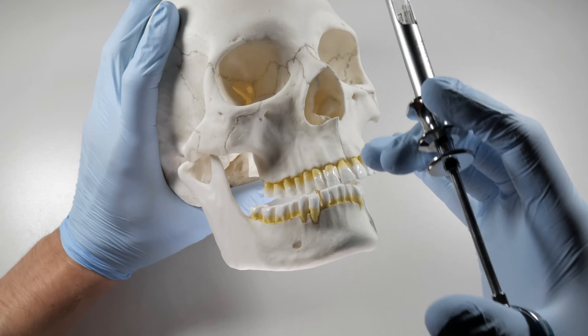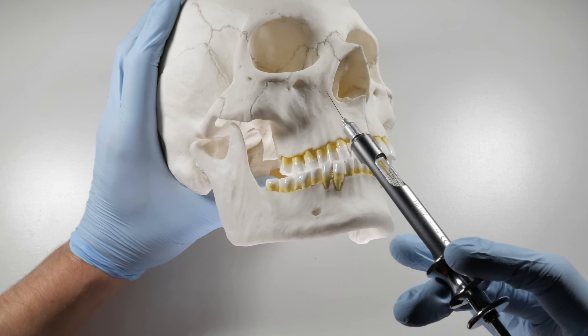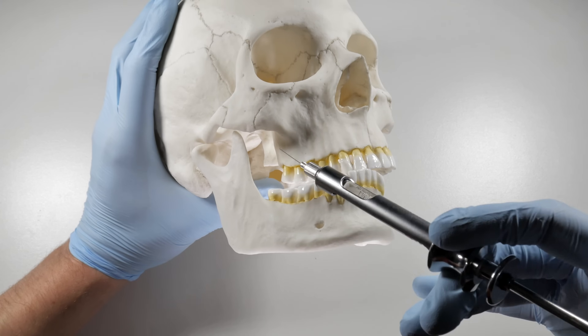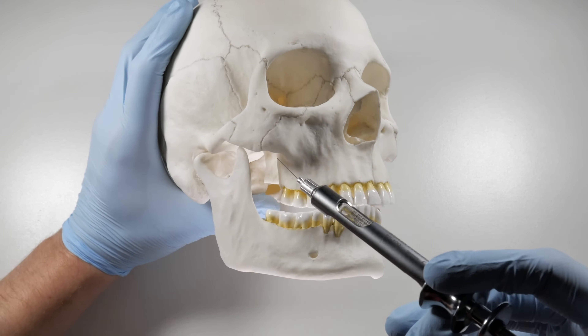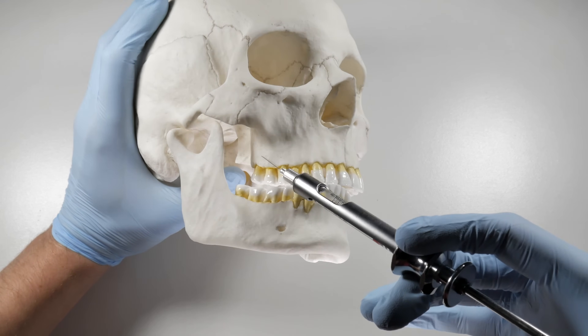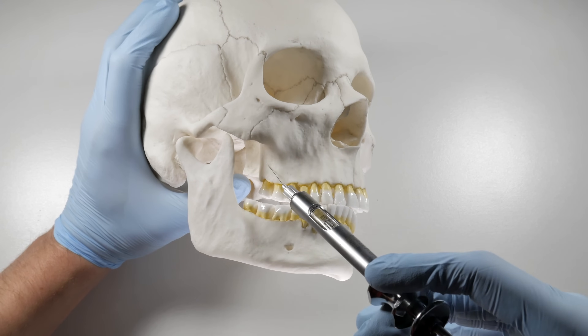The angle of insertion, as we've known, is 45 degrees — specifically 45 degrees superiorly, 45 degrees posteriorly, and 45 degrees medially. The reason for this, if you can get a good look at the anatomy back here, is because the tuberosity kind of curls around. You're trying to mirror that bone, or follow that bone.